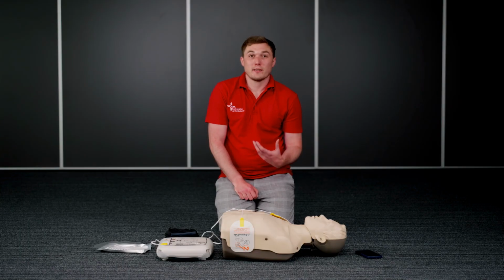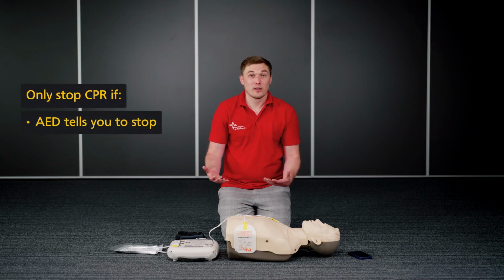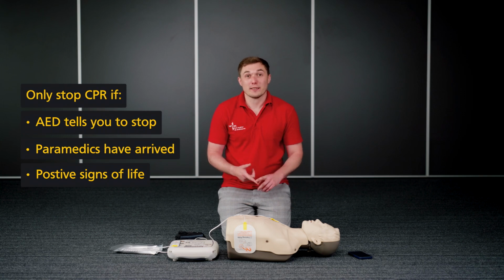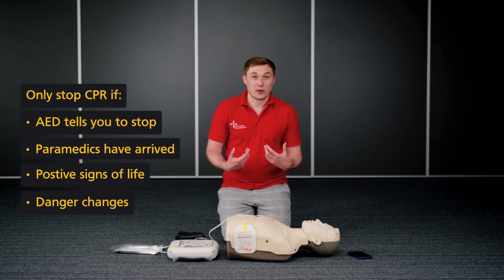Every 2 minutes, the AED will analyse if there's a shockable rhythm or not. There are several reasons why you would stop doing CPR. One of those is when the AED tells you to stop delivering CPR. The second is when the paramedics arrive and we've done a successful handover. The third is when there's positive signs of life. And the last one is if at any point that danger level changes. If it's not safe for you to carry on delivering compressions, and one of those reasons could be physical exhaustion, we are going to stop doing compressions and maintaining our end safety.